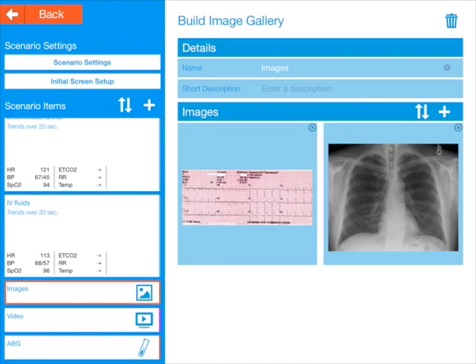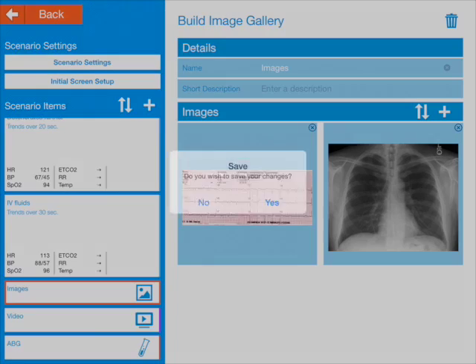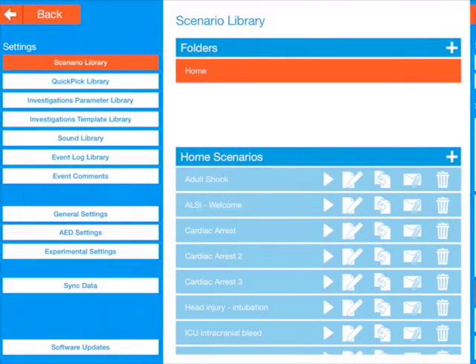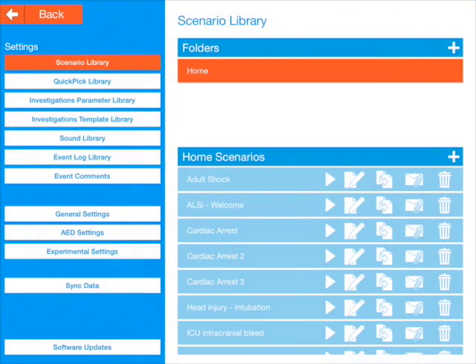Okay, so we've added all of those to the scenario. Let's go back — I'm going to save those changes. We can play it straight from the scenario library, so we press the play button for Adult Shock.